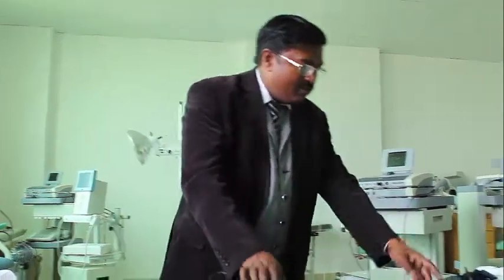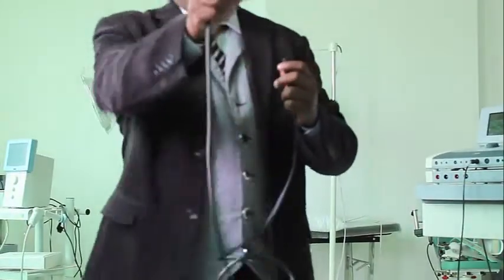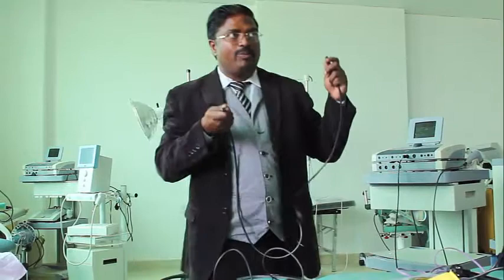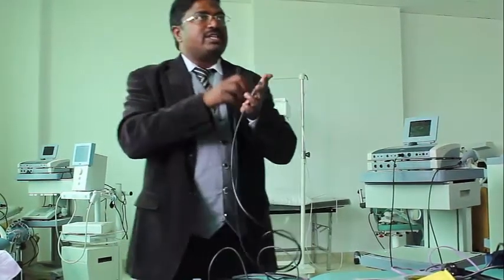Okay. Now you have vacuum. Vacuum means when you apply pressure, you know a vacuum cleaner? Similarly, it applies vacuum. It gives a vacuum and it sticks the electrode to the skin.